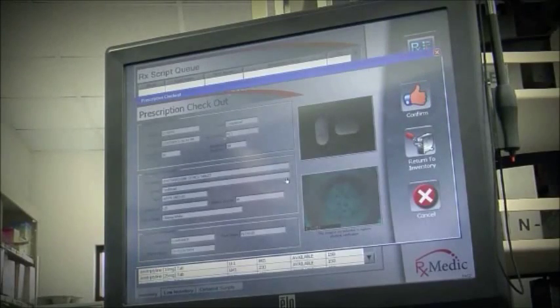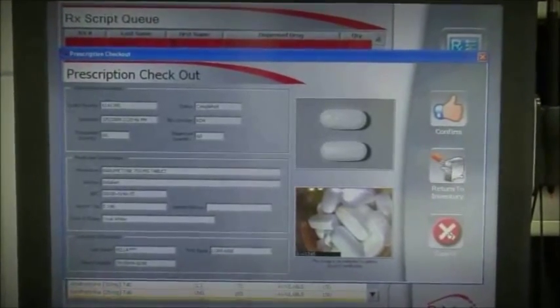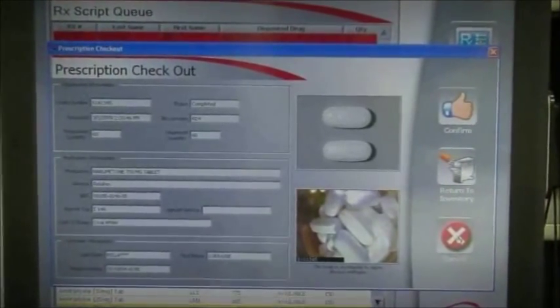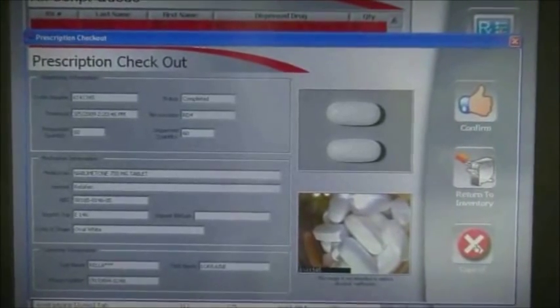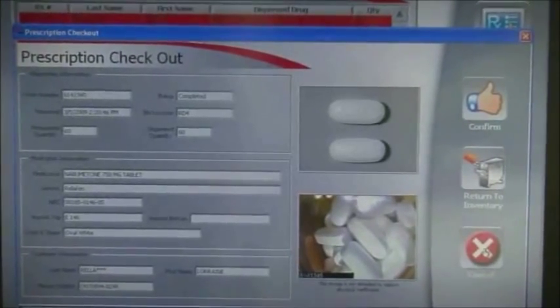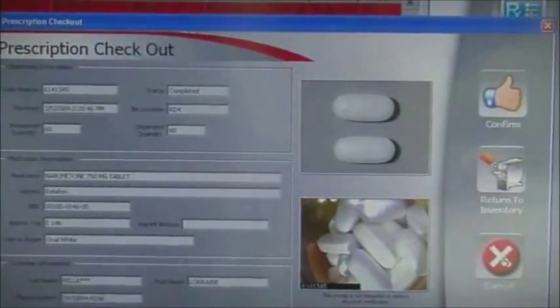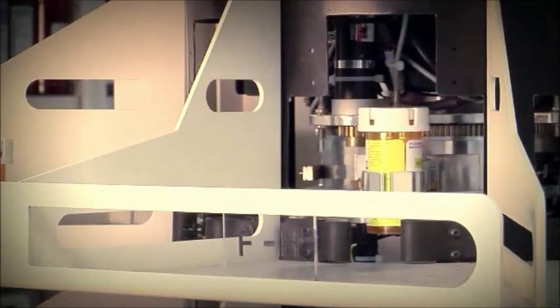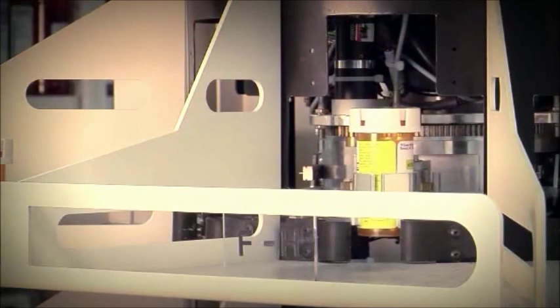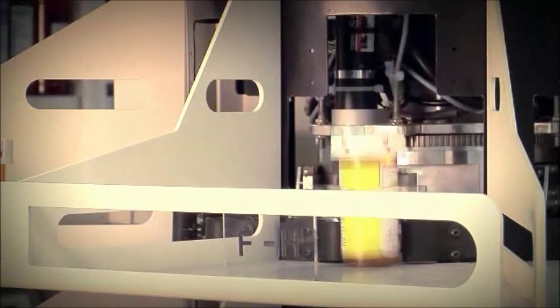Next, the robot takes a high quality digital image of the contents of the vial and applies the cap. The digital image provides another essential safeguard in the dispensing process. This image is stored and can be retrieved should a patient ever have a question about a particular prescription.